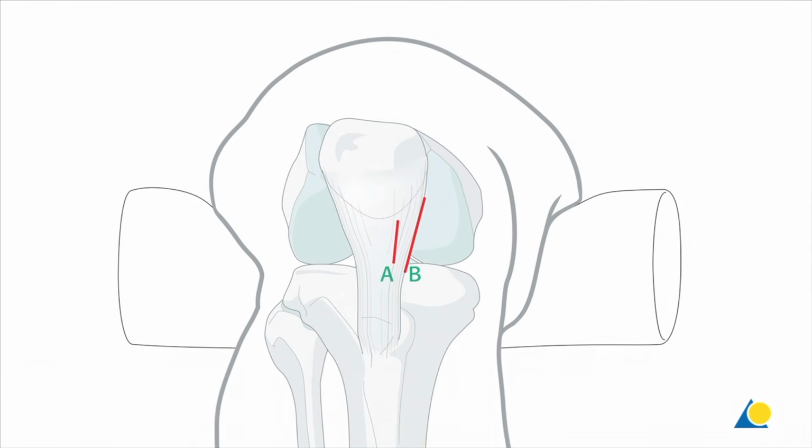The incision may go either through or around the patellar tendon. It is important that it is made directly in line with the medullary canal. This may only be possible by going through the tendon, A, but if the tendon can be retracted sufficiently for direct access, this is also possible, B. Proximal tibial shaft fractures tend to develop a valgus deformity if the nail entry site is placed too medially. A more laterally placed skin incision may be needed to avoid this problem.